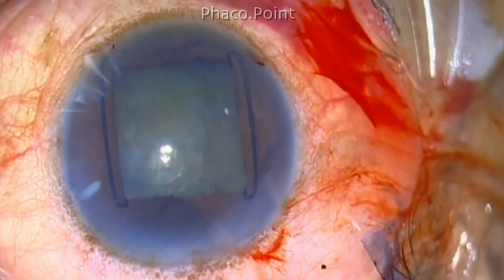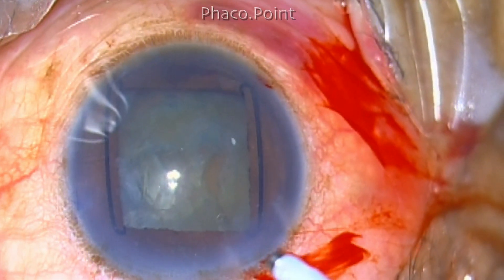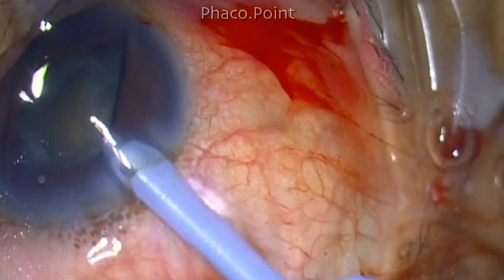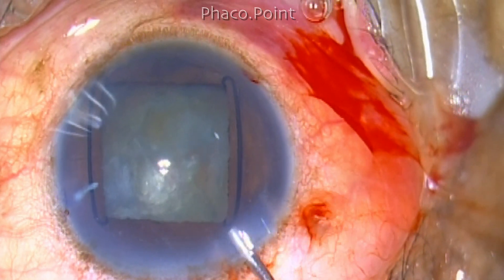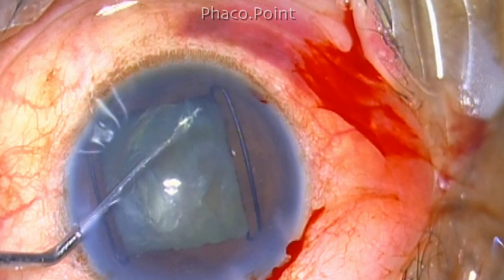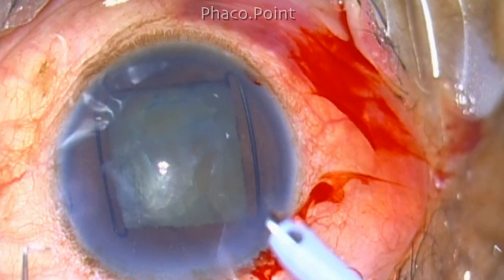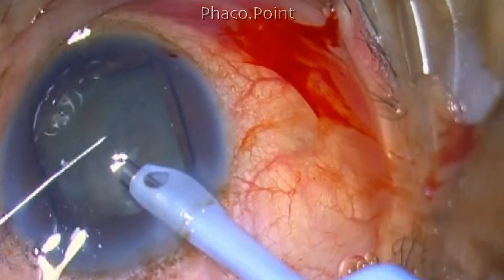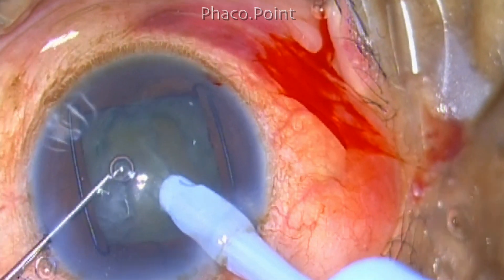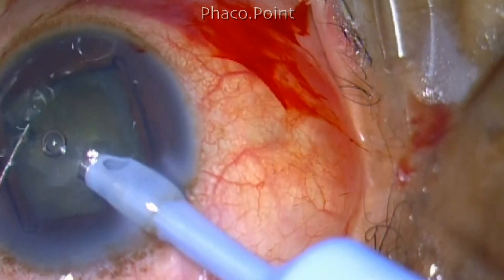Hydrodissection is performed, the nucleus rises gently, the lens is rocked, and I am getting ready to perform phaco emulsification. With a sharp-tip chopper in my left hand and the phaco probe in my right, this is a grade 3 nuclear sclerotic cataract. I am doing direct phaco chop using a power of 40% in multi-burst mode, a burst duration of 30 milliseconds, and a duty cycle of 70%.